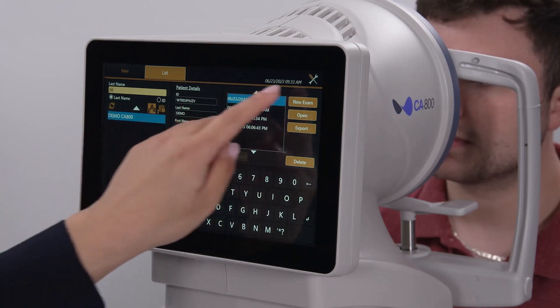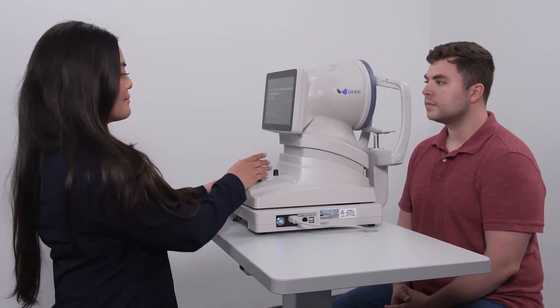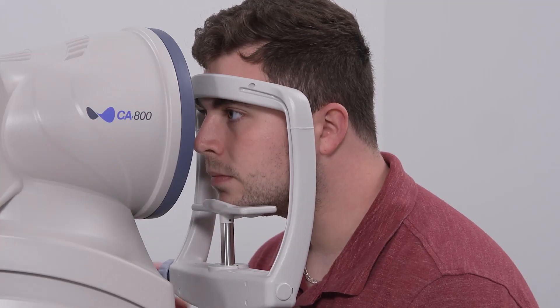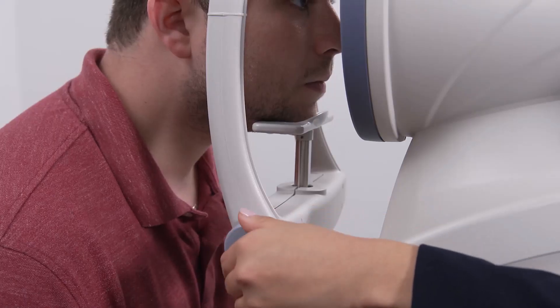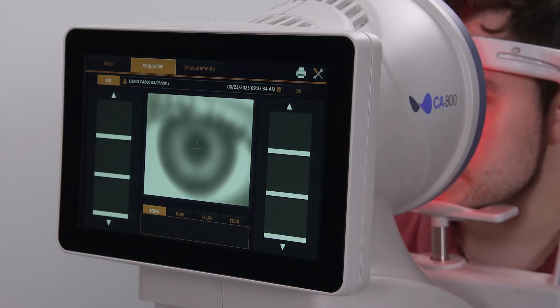Simply select the patient and activate capture. Pull the CA800 right back towards the operator, then position the patient with their chin down and forward in the chin rest and their forehead against the band. Adjust the chin rest height so the eye is aligned with the canthus marker. Adjust the table height as necessary for the patient's back and neck comfort.